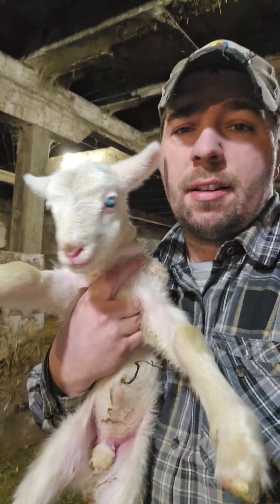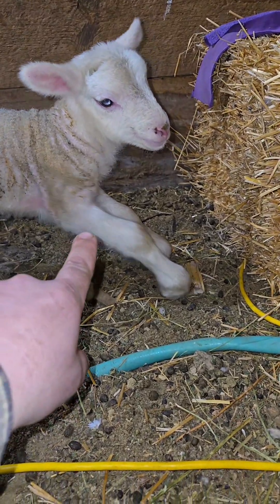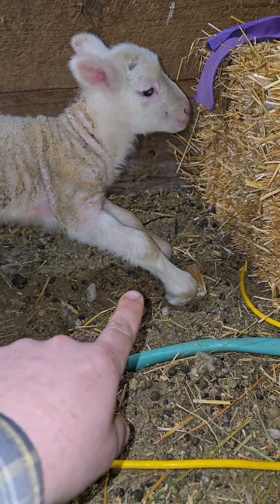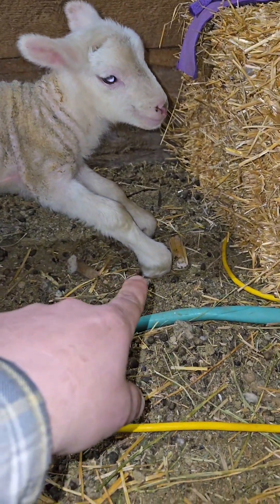Well, the time has arrived. Let's fix this little guy's feet. What we've got here is a healthy little buck lamb, and you can see he's got contracted tendons from the upper portion of his leg to the lower portion. But the way he's standing, he will put tension on those and they'll straighten themselves out. What I'm worried about is his feet down here. Right now he is walking like this — it's actually putting weight on the front of his hoof, which means his natural stance is not going to stretch out the tendons in his wrist essentially.